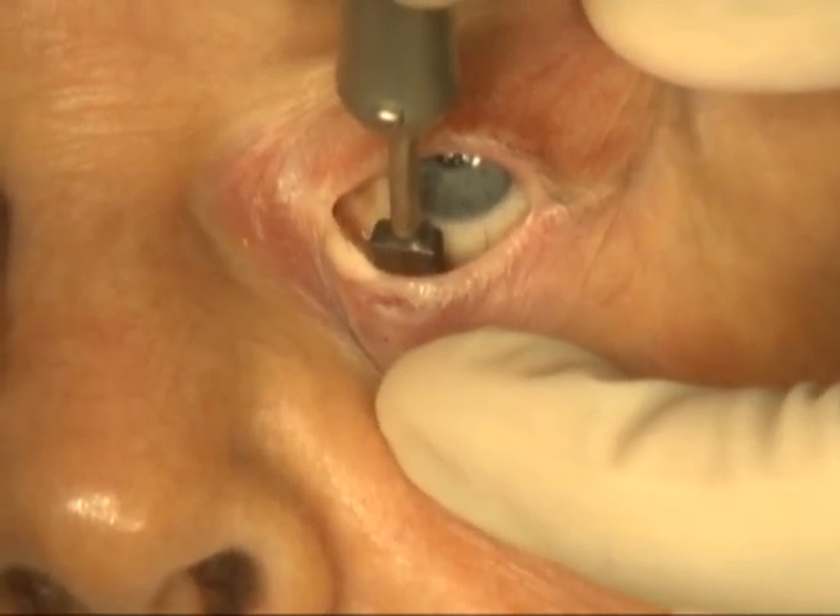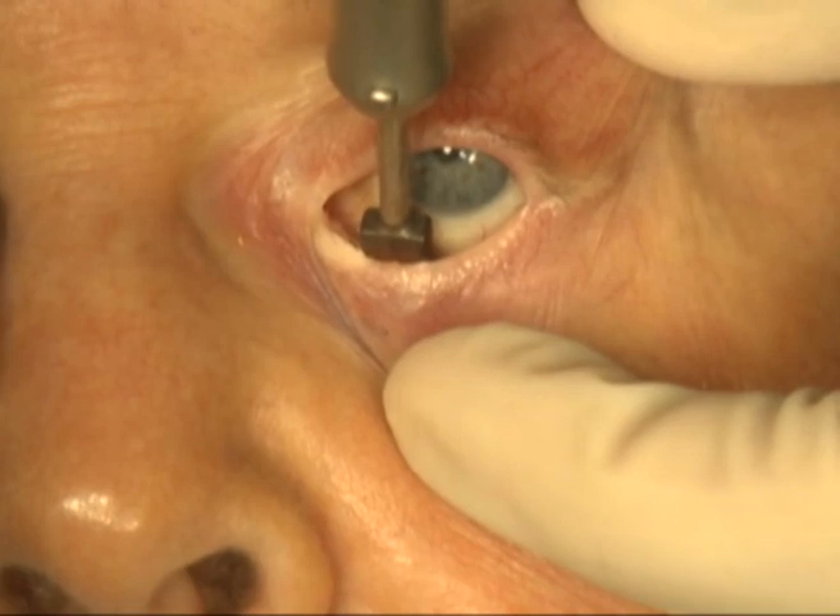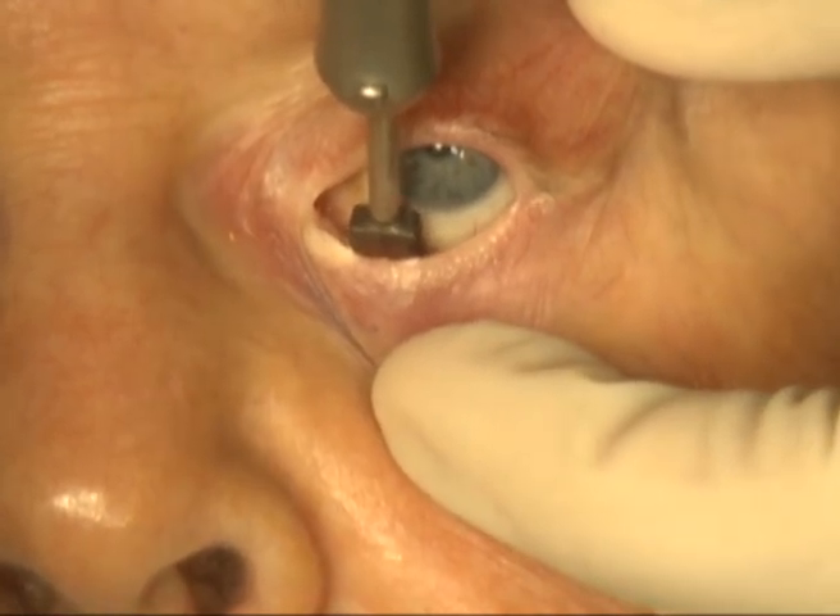For the upper eyelid, the lashes are a bit more resistant to cryotherapy and a freezing of approximately 35 seconds is performed.